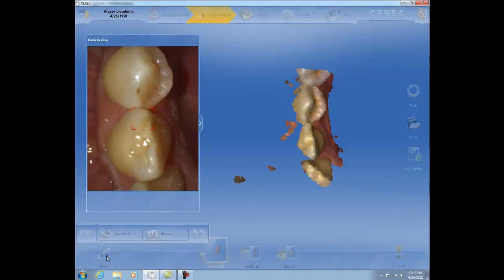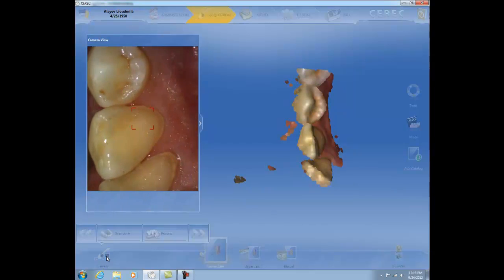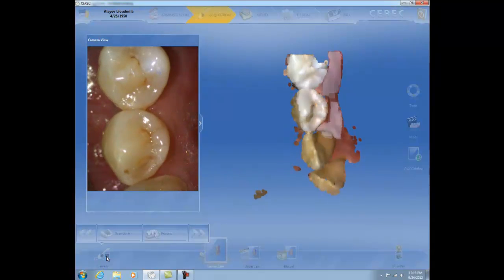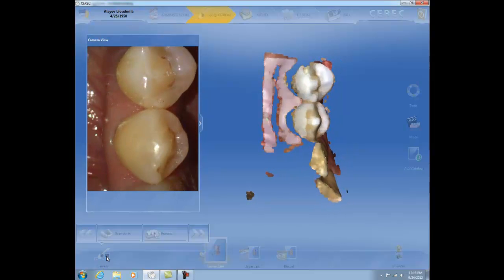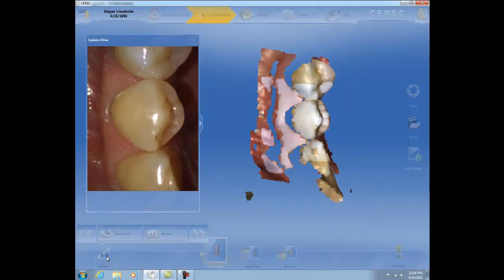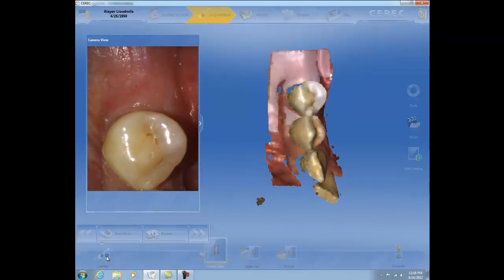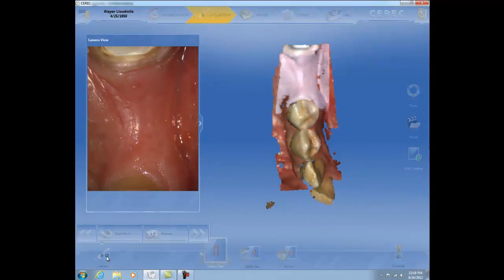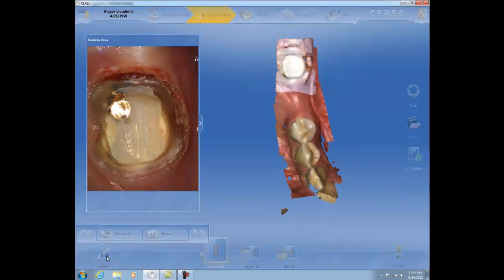You can see in this picture that when you scan the anterior teeth, it doesn't catch the data. So make sure that you go to the premolar area where you have a wider surface area. Then you will proceed anteriorly or posteriorly. In this case, I start with my premolars and slowly go back, to make sure I have all the data necessary to proceed with the case on number 31.